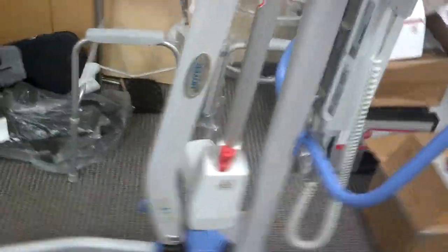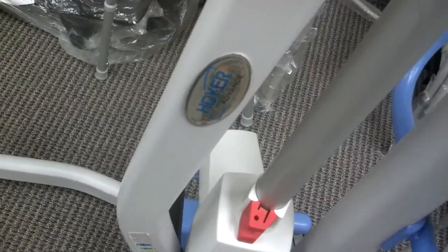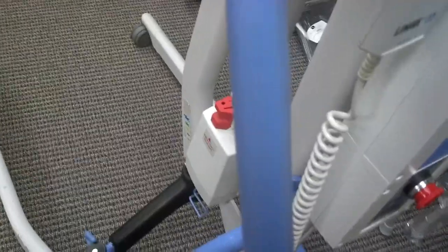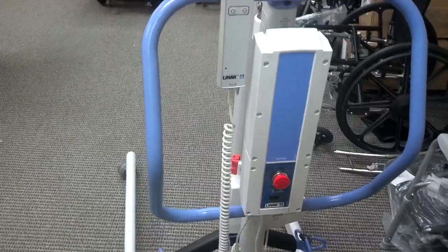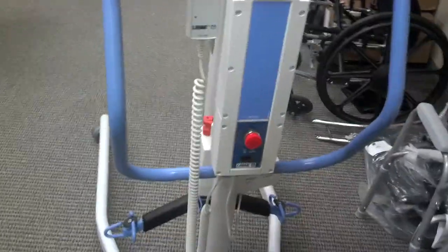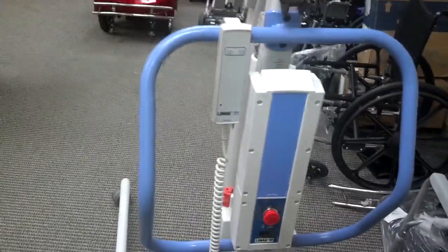Hello, today I'm going to be showing you the Advanced Hoyer Lift, which is a new product that Sunrise has come out with. This is the only portable lift that's available out in the market. It is listed on our website at GoSouthernMD.com, and I'm going to show you some of the things that this thing can do.